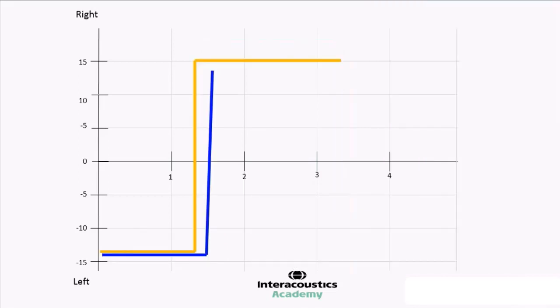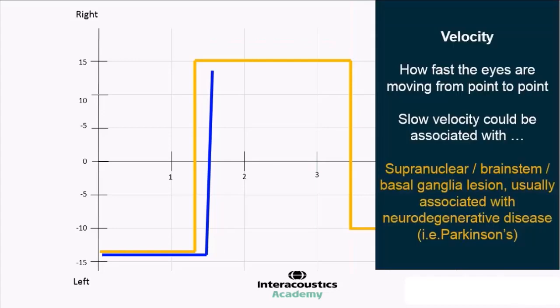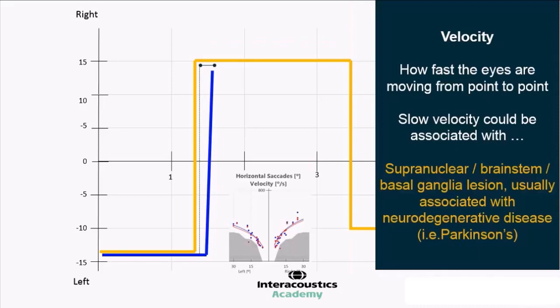Our next parameter to look at within the saccade test is velocity. So how fast does the eye move after being initiated following the target? Again, we can look at normal data, both for age, gender, and we can have a look at whether a delay in this eye movement, again, is present either in unilateral or bilateral directions, again, horizontal or vertical.